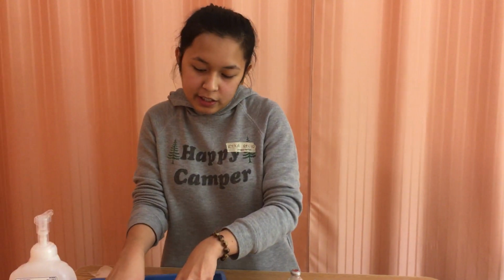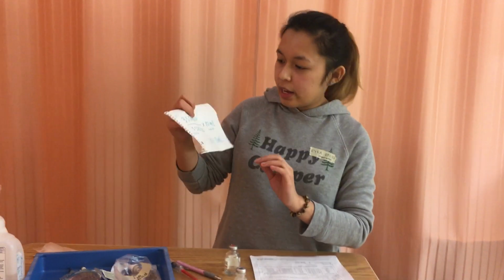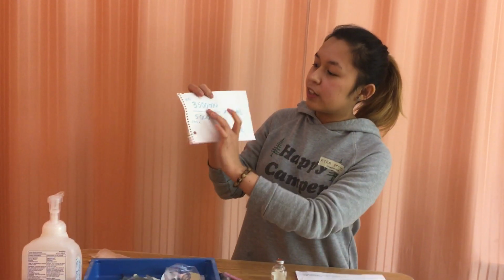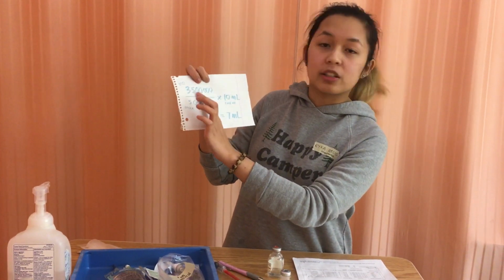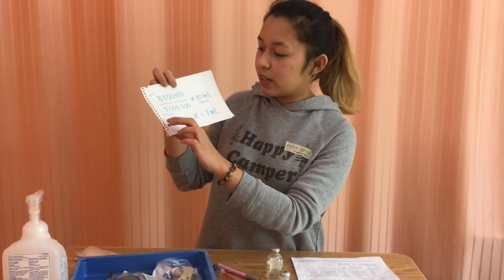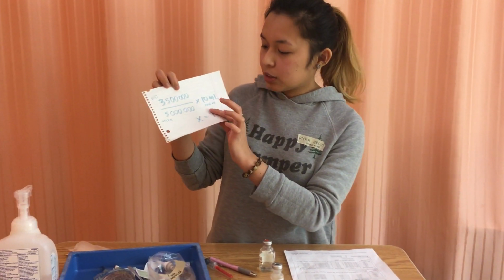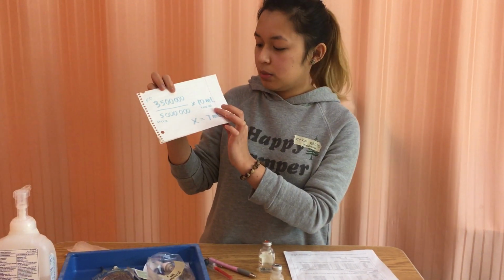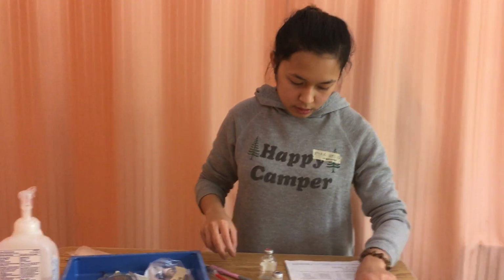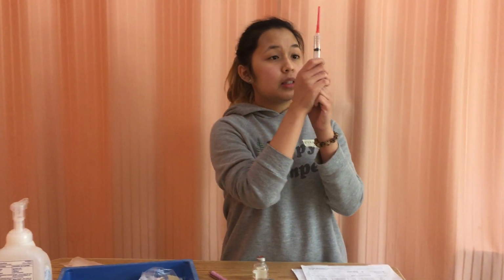I've also calculated the volume that I have to draw up. I took the doctor's order, which is 3.5 million units, and divided that by the stock dose, which was 5 million units, and multiplied it by the final volume, which is 10 milliliters, and I got the volume of 7 milliliters, and this is how much I have to draw up. So I'm going to grab 7 milliliters.